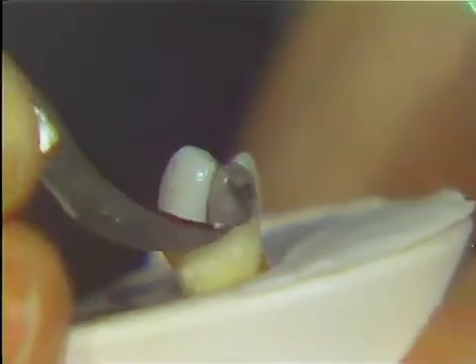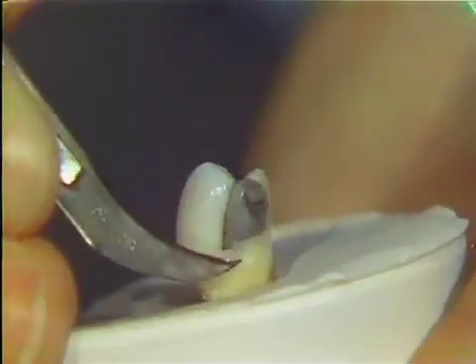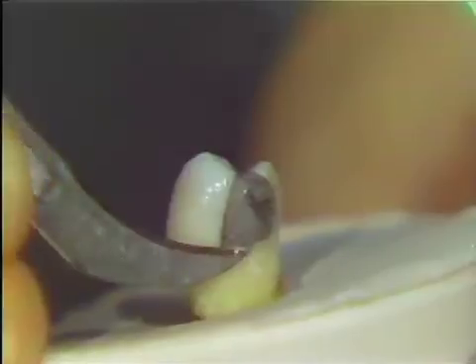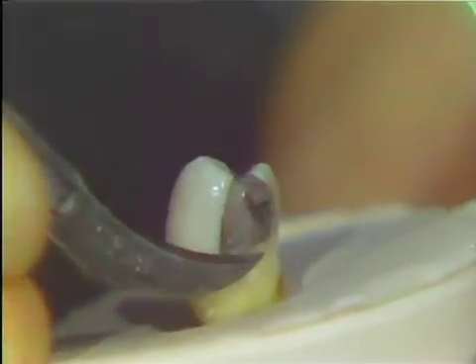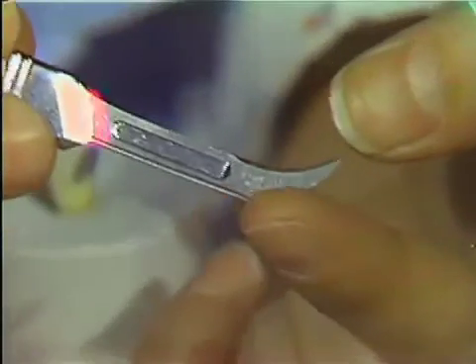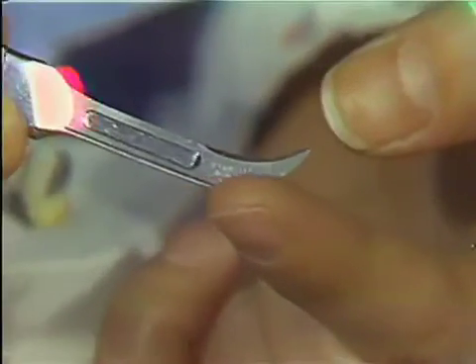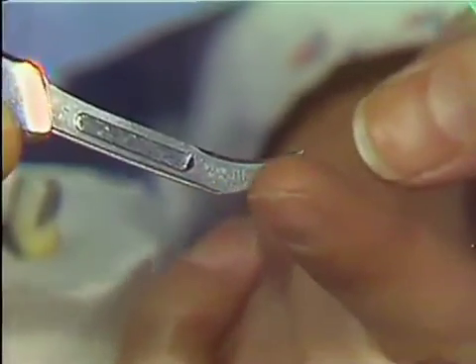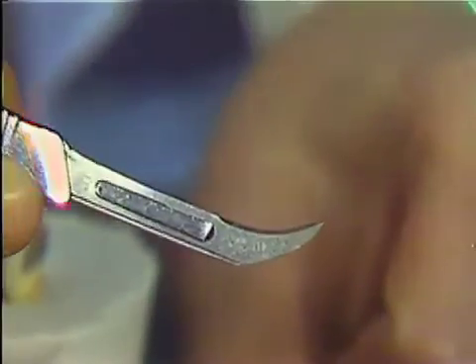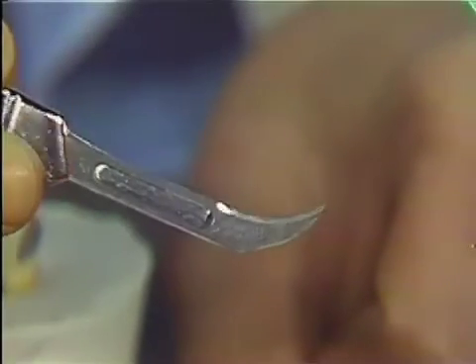Now let's move to the interproximal surface itself. There's no real overhang here, but you can see how you would get under the overhang — a short, concise stroke — and use only the tip of the instrument. If you wish, you can place a small piece of masking tape right over this area so that you don't do any damage to the gingiva when you're using the Bard-Parker. But this is basically how this instrument is used.